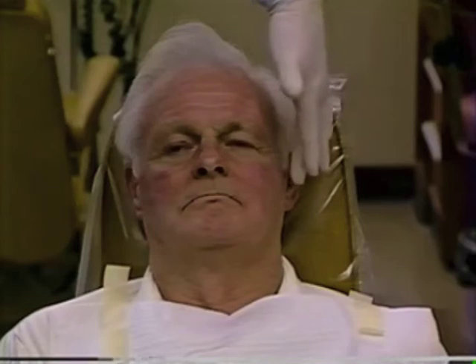In selecting teeth for the patient we're going to be first of all making a judgment on the size. The size of a maxillary central incisor should be approximately 1/16th the size of the face — from the pupils of the eye to the bottom of the chin, and 1/16th the bizygomatic width of the face.